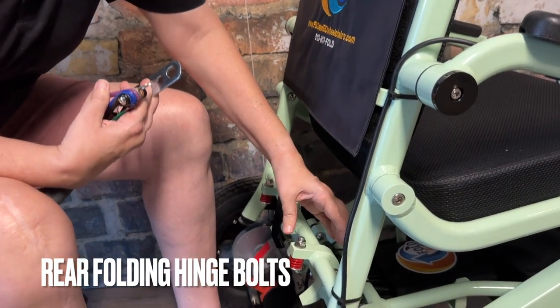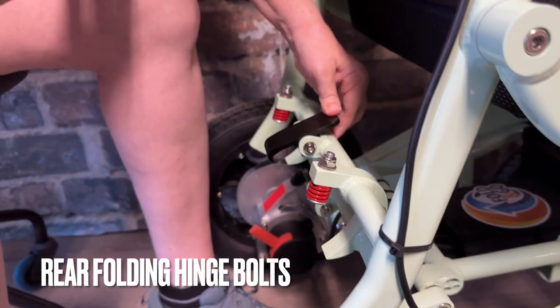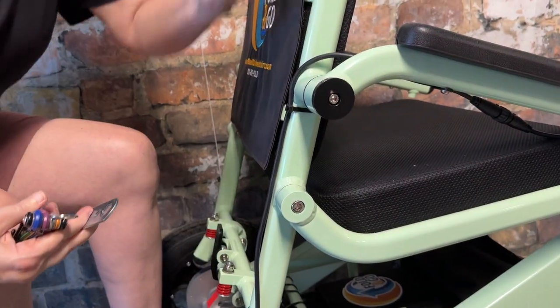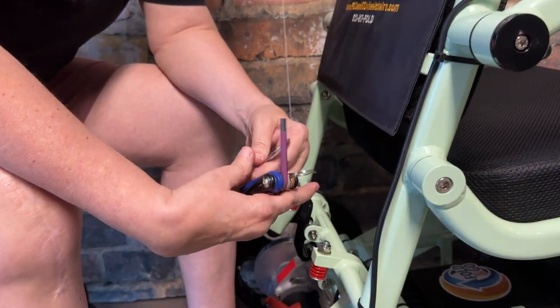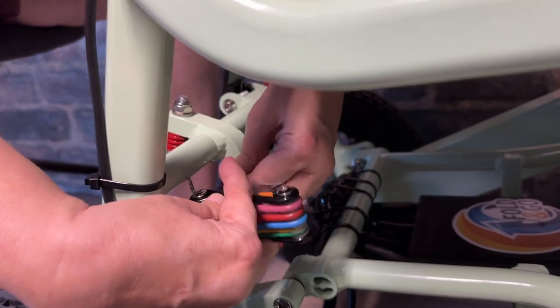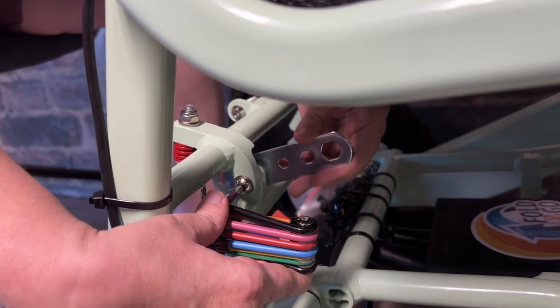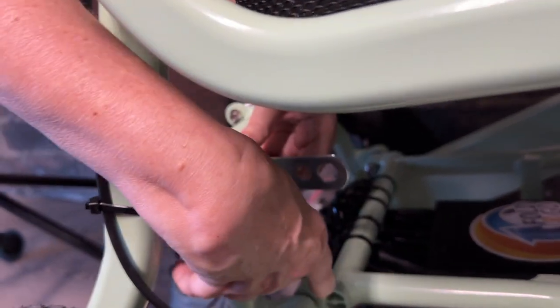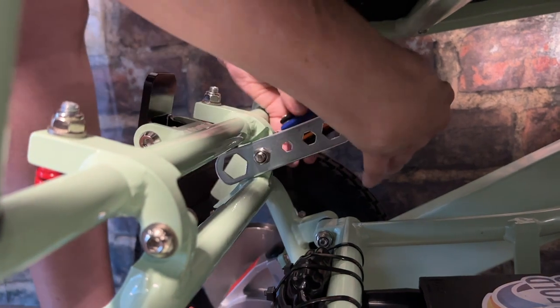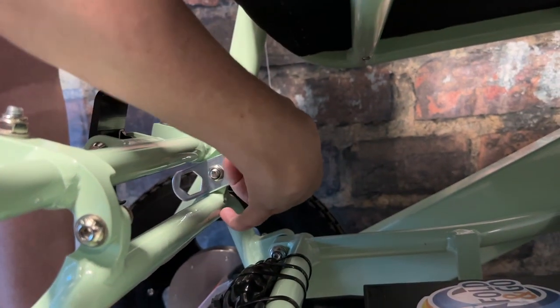Now we're moving towards the rear of the chair to tighten the rear folding hinge bolts, which are right in front of the frame lock. Position the chair partially closed and push the backrest forward a little bit — this gives you a better angle to reach those bolts. Use the purple hex bolt and line up the makeshift wrench with the bolt size. Righty tighty, lefty loosey — do both bolts, one on the right and one on the left. These bolts are also right in front of the red springs, which will help you find them.